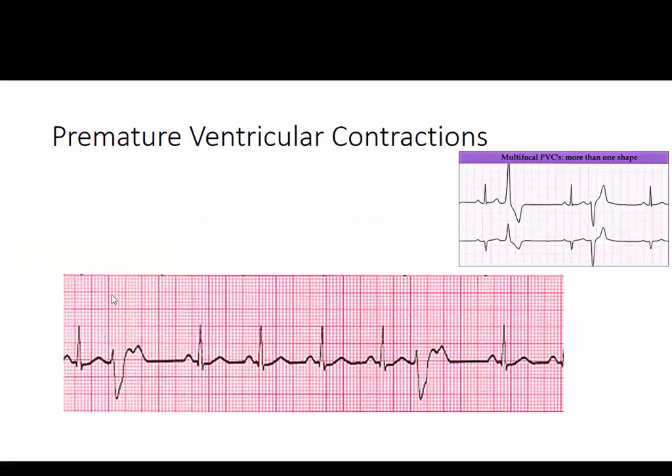So that's sinus bradycardia. And then we have, a lot of us unknowingly have these other rhythms that just pop in every now and then. Have you ever had too much caffeine and your heart kind of goes boom, boom, boom? And you wonder, oh, what was that?